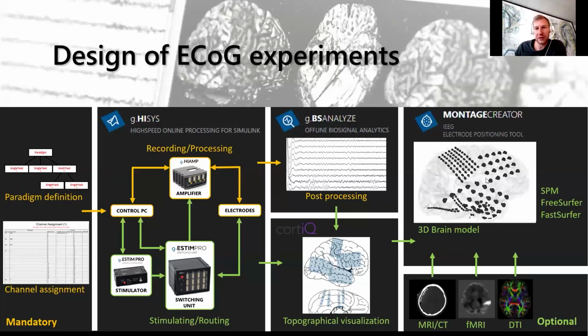In order to understand where in the brain our sensors are located, so that we can, for example, decide based on the region of interest which sensors are useful, we need to have at least an MRI and CT scan. Here we can see that not only the geometry of the grid is visible, but also the location of the electrodes directly on the cortex.